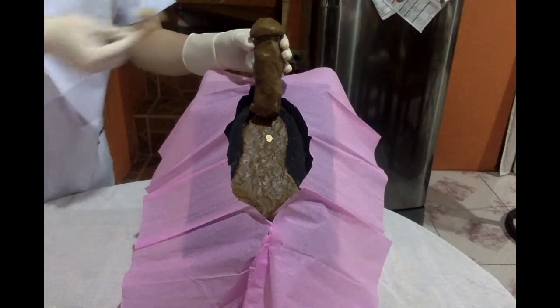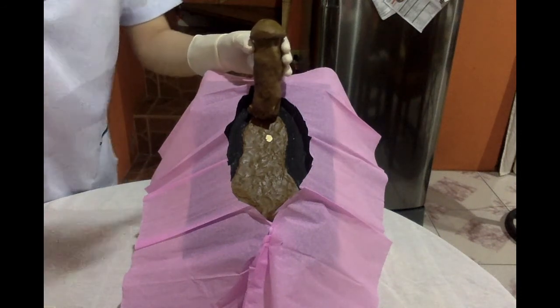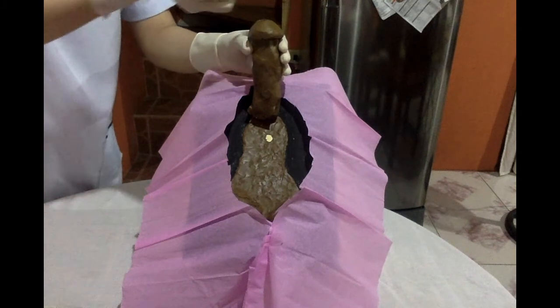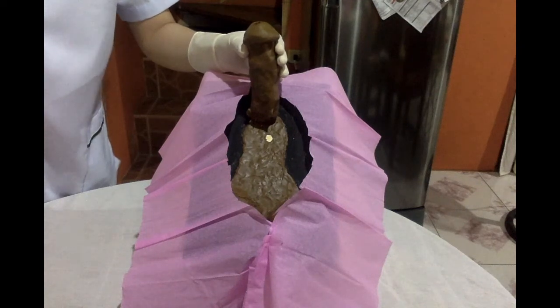Then discard. Again. So be careful not to cross the sterile field with the used cotton ball.